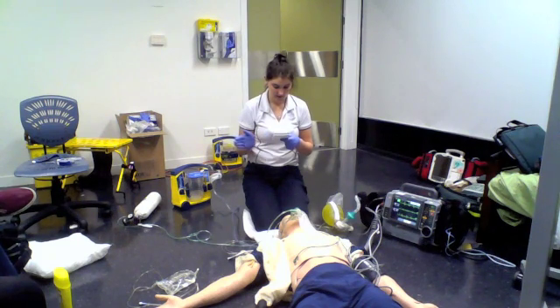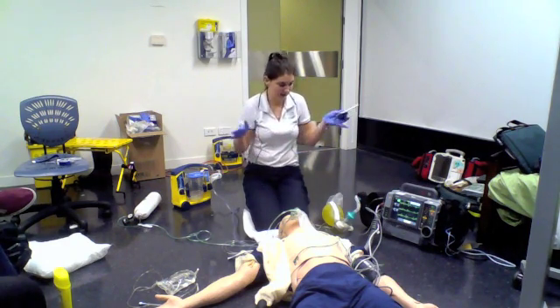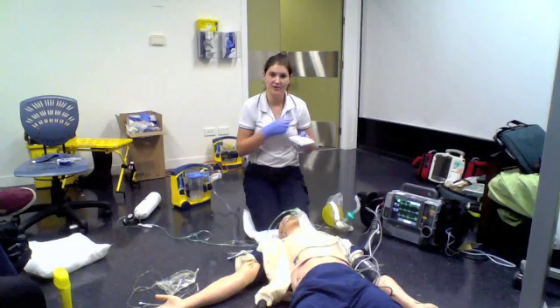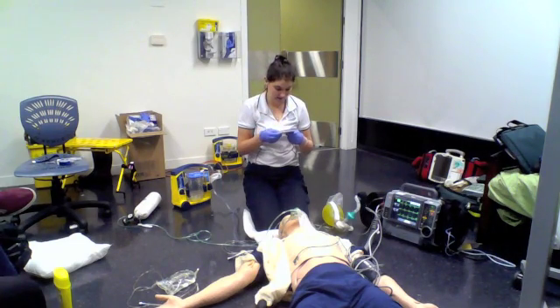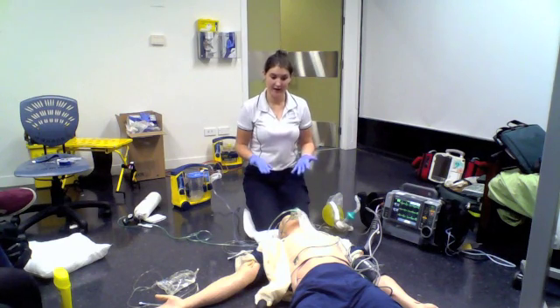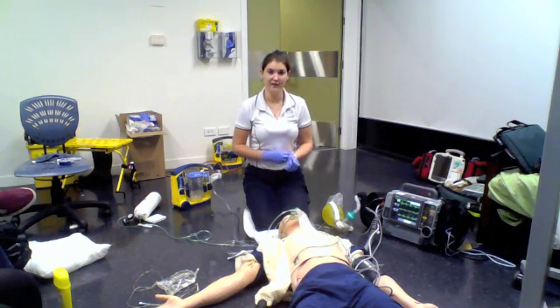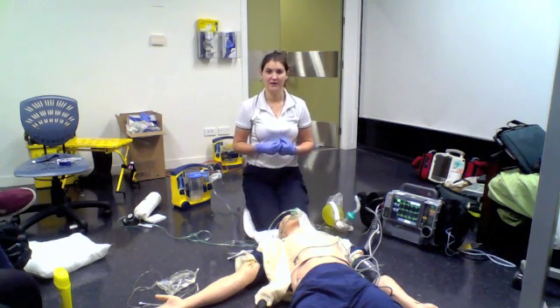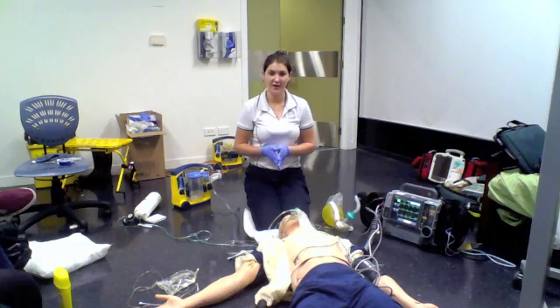We've prepared the area. The patient is in an ambulance, but if we were elsewhere, we'd just maintain a nice clean working area, only having the things that we need out. We'd consider moving the patient to backup. That's all for that. If the patient was combative, which he is, we could give him morphine to settle him down a little bit. It would be safer for him and us if we did. We could give between 2 and 5 milligrams of morphine IV.